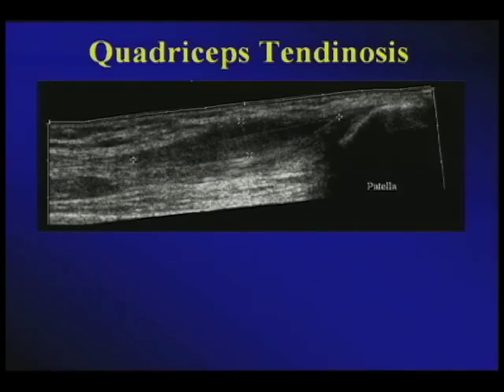When afflicted with some lesions, the quadriceps tendon ordinarily will start with some degenerative changes or acute traumatic changes of tendinosis. Here in the long axis view, in an extended field of view, you appreciate that as the quadriceps tendon inserts into the base of the patella, you've lost the fibrillar pattern that you were expecting.